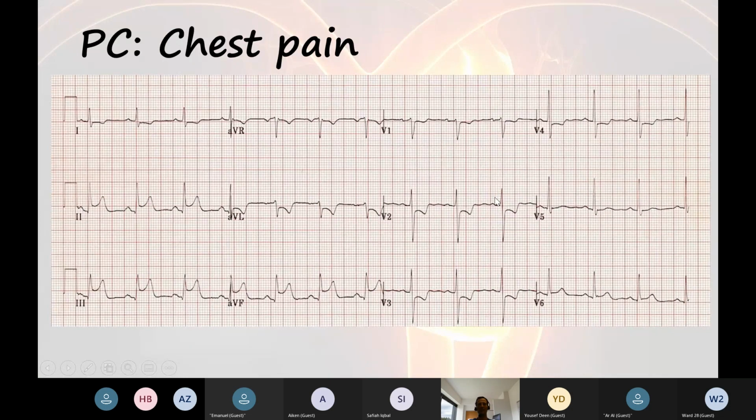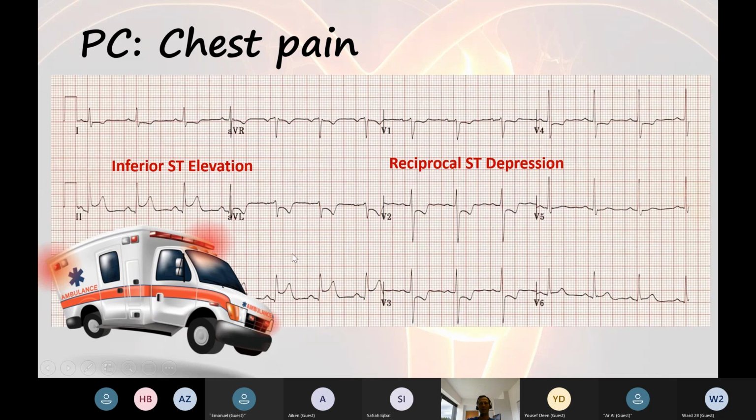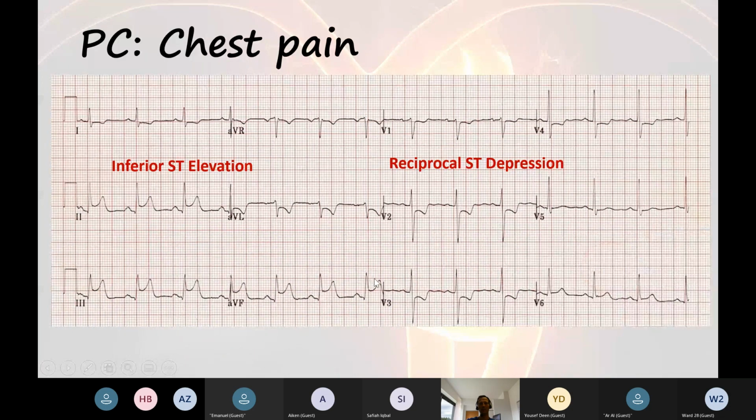But I'd only be doing that for entertainment while waiting for the patient to go straight to the cath lab, because this sort of patient needs an immediate coronary angiogram. They've got inferior ST elevation and there's lots of R wave here, so you know they've not fully infarcted, and there is ST depression elsewhere in the ECG, which could represent a posterior STEMI, but reflects the fact that this is acute ischemia as opposed to something like pericarditis, which can cause saddle-shaped ST elevation and can rarely be focal.